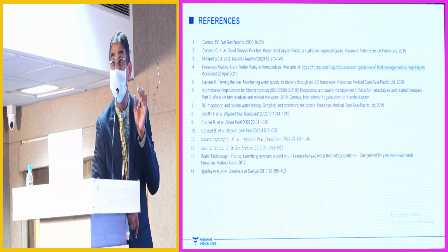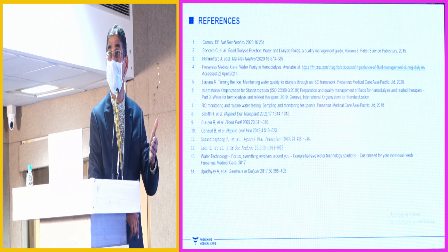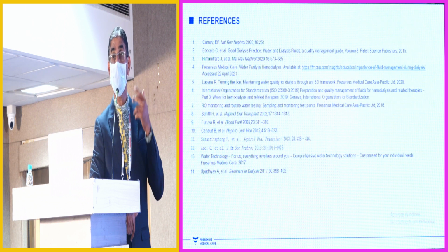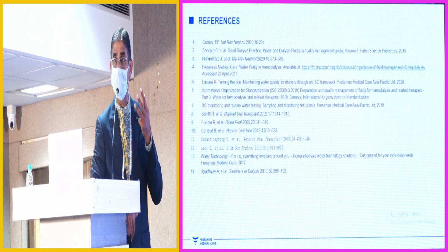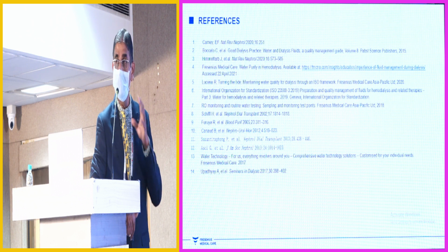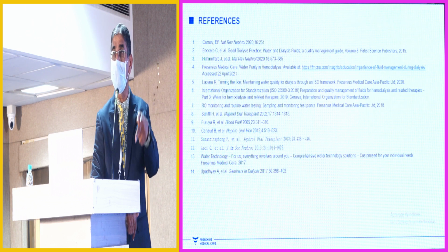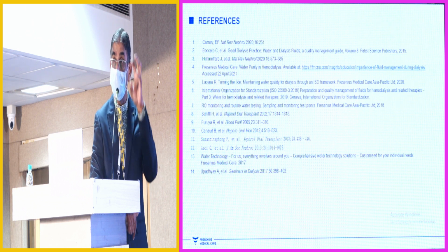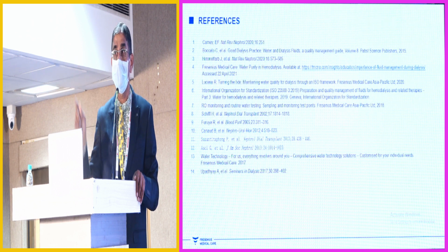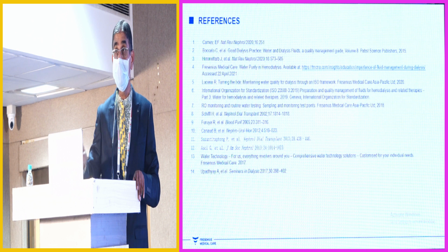If you can't achieve the ISO standards, I would say put a portable RO system if it is for online HDF. And then they will also talk about the cost, but cost I can come and tell you how to take back that. Maybe the initial investment is there. Already existing RO system is again going to go through the second one, which will enable you to achieve the ISO standards of CFU less than 0.1 and an endotoxin of 0.03 per ml.